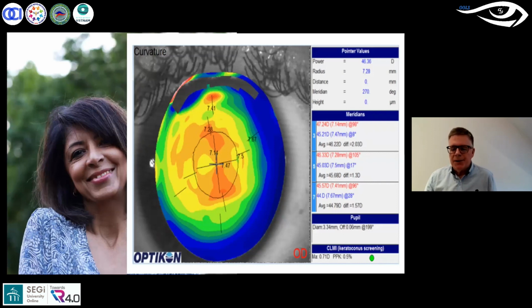And this was fascinating because this gave us a lot of light in terms of what happens with any cornea, and you can see that Ros has a pupil diameter of 3.34 millimeters. I'm just showing that there, and you can see that within the pupil we have this lovely figure of 8 image, which is with the rule astigmatism, and this is just over 2 diopters.